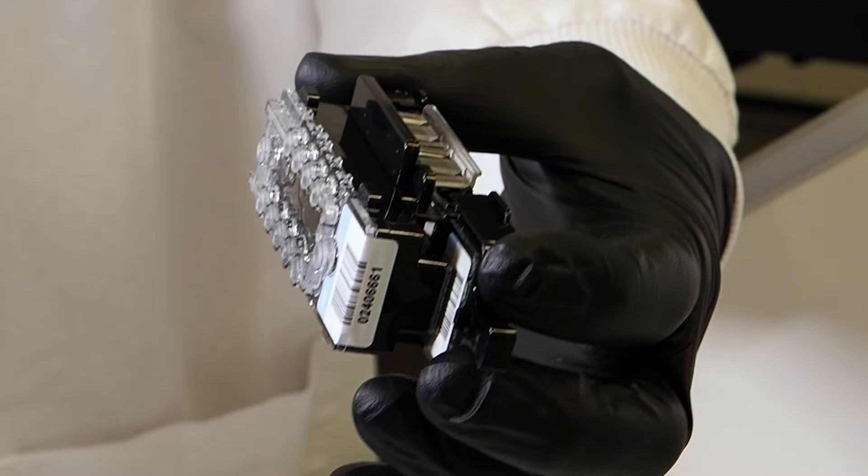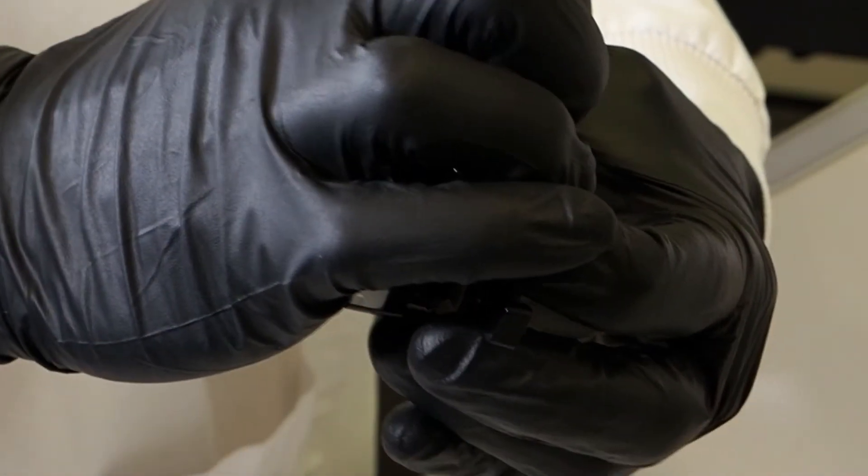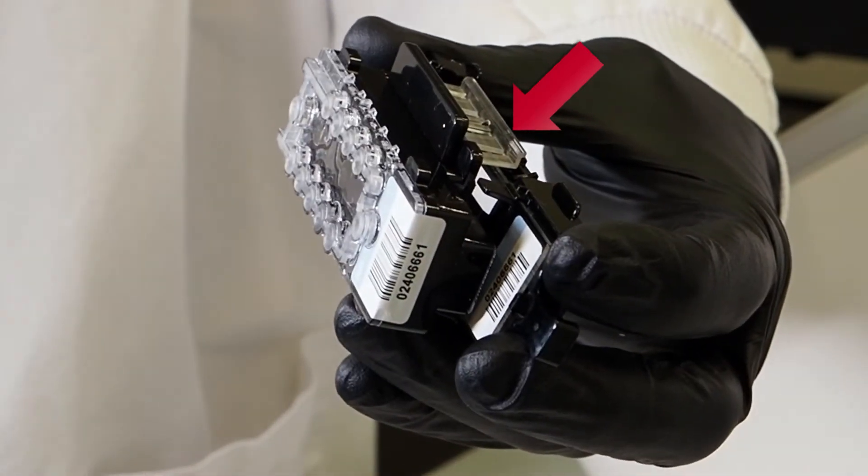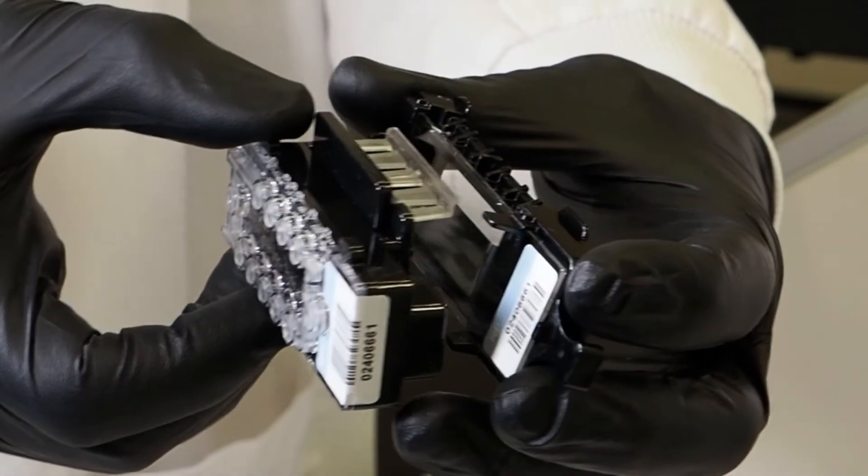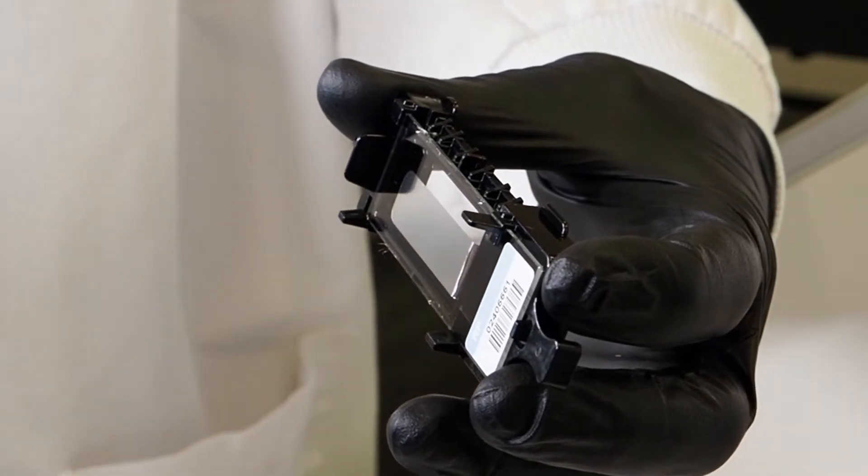Use one hand to grasp the substrate holder. Use the other hand to lift the clear plastic retaining clips along one edge of the reagent pack. When one side of the reagent pack is released from the substrate holder, the two pieces will easily separate.